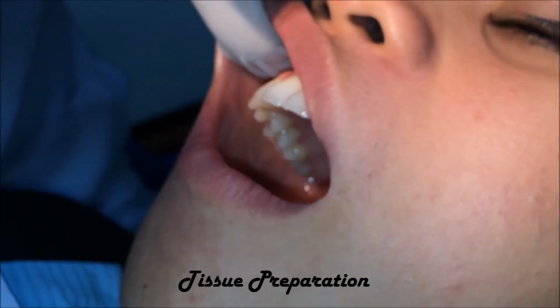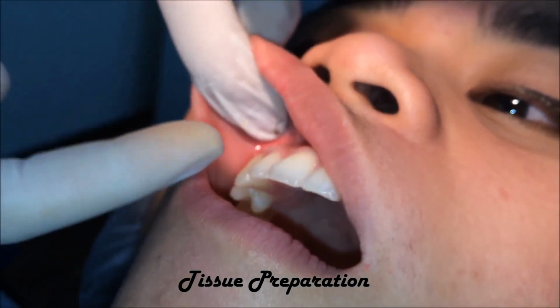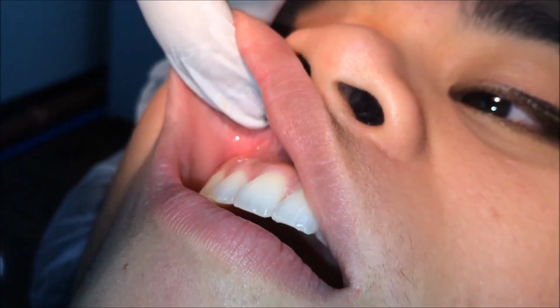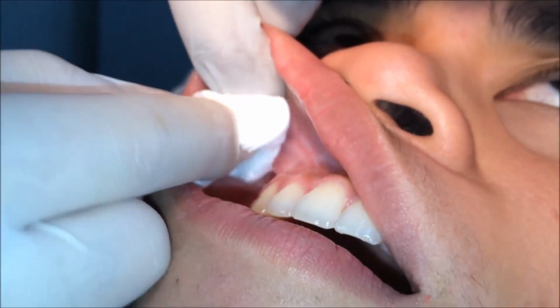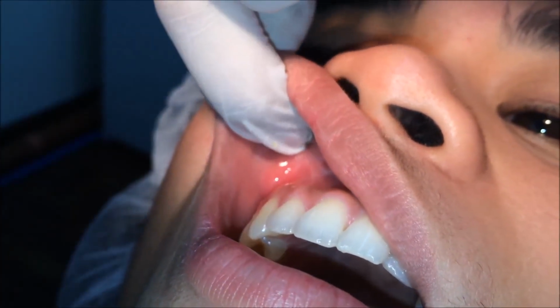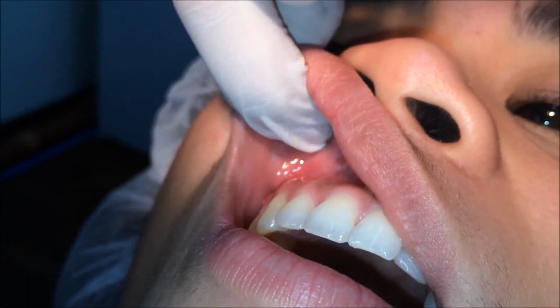First, we are about to prepare the tissue at the site of injection. We clean with a sterile dry gauze. We have to dry this part so the topical solutions will be absorbed rapidly.